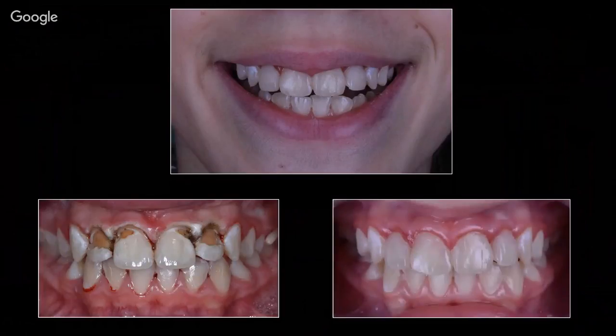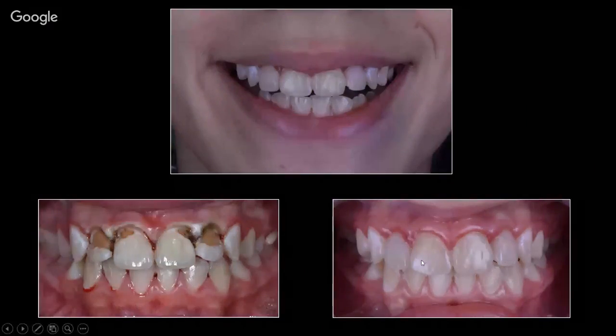And right now, you can see I need to ameliorate the lateral shape as well, to make some vertical grooves, to make it smooth. And we can see as well, still there is some inflammation.